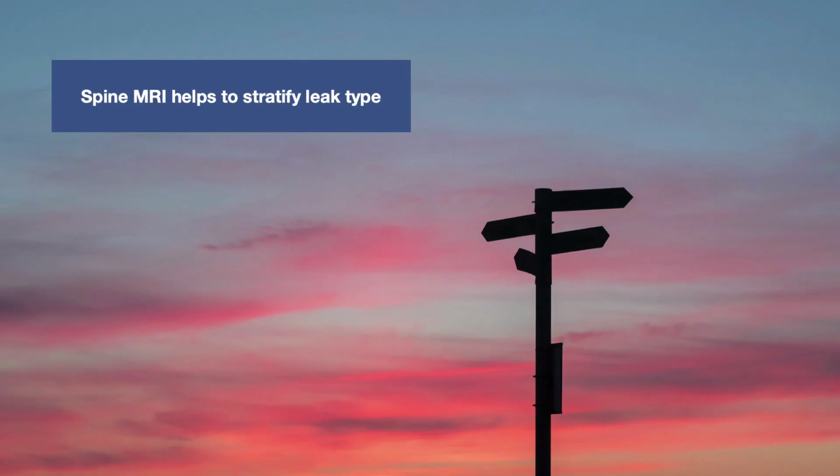So we usually perform a spine MRI at the same time that we perform imaging of the brain. And the reason for the spine MRI is to help stratify the type of leak, i.e. is it a fast or a slow leak? And that is determined by the presence of a SLEC or not. And this helps direct us to the etiology of the leak and therefore direct an appropriate myelographic strategy to find it.